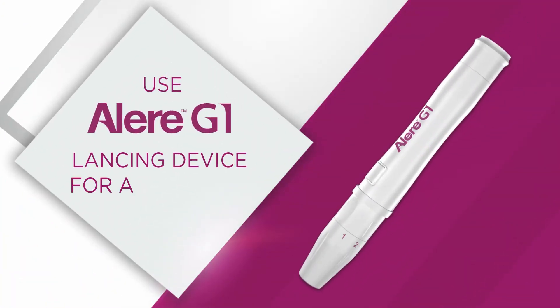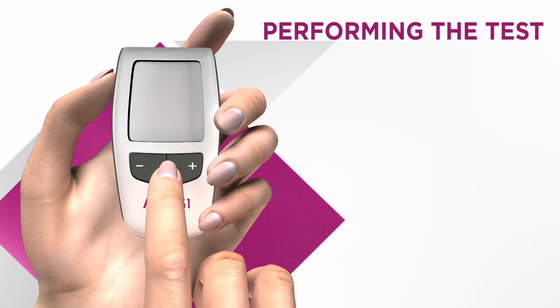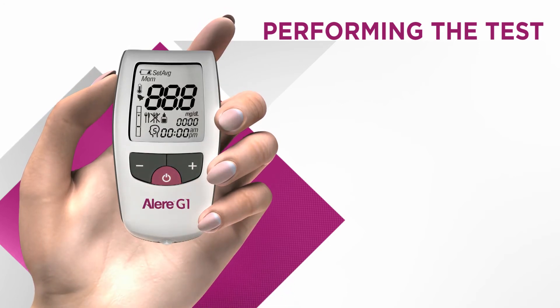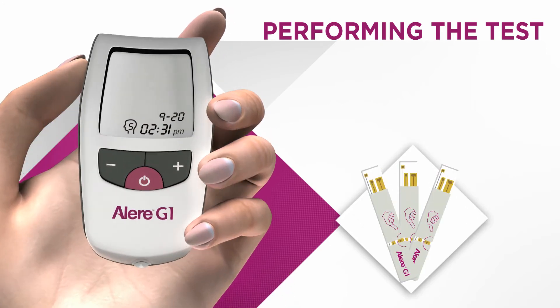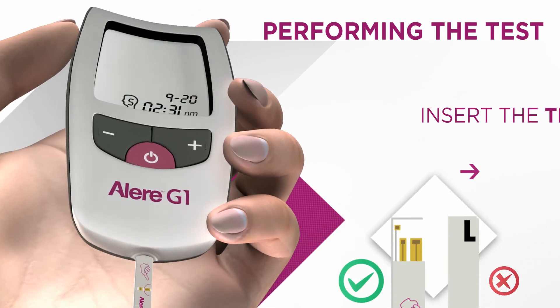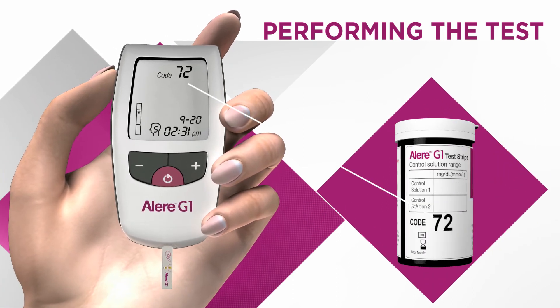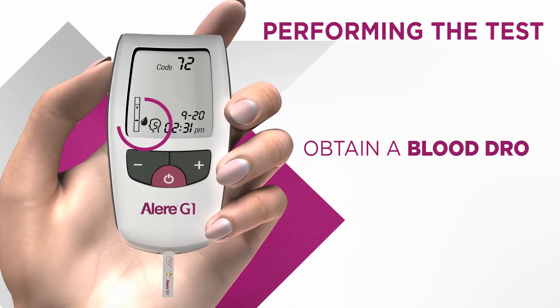Now prepare your lancing device. For a pain-free experience, use the Alere G1 lancing device. Press the power button to turn on the monitor — a strip icon will flash. Insert the strip gold end first. A code will flash on the screen; match the code with that on the vial. A blood drop icon will now be displayed.